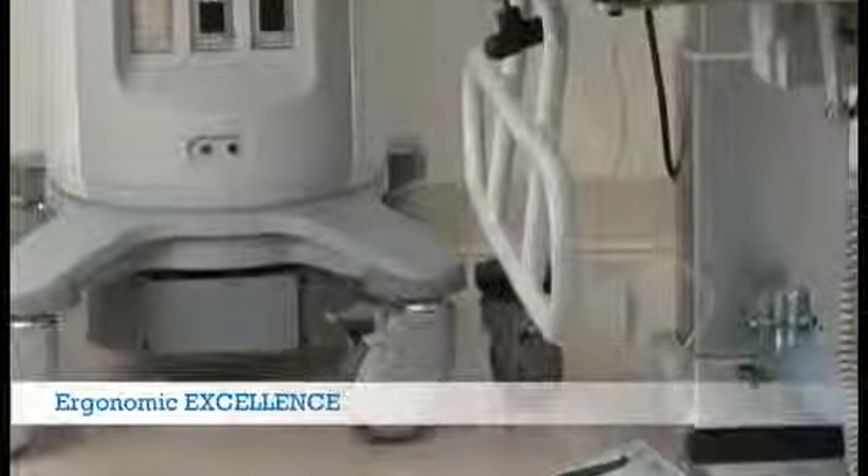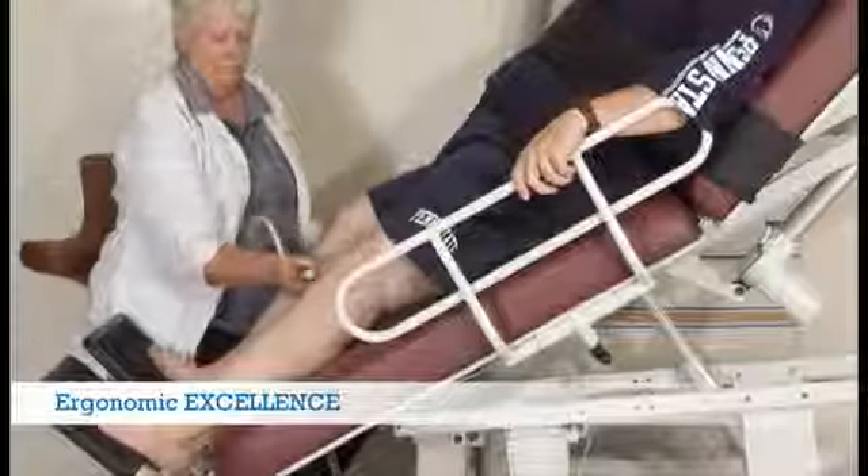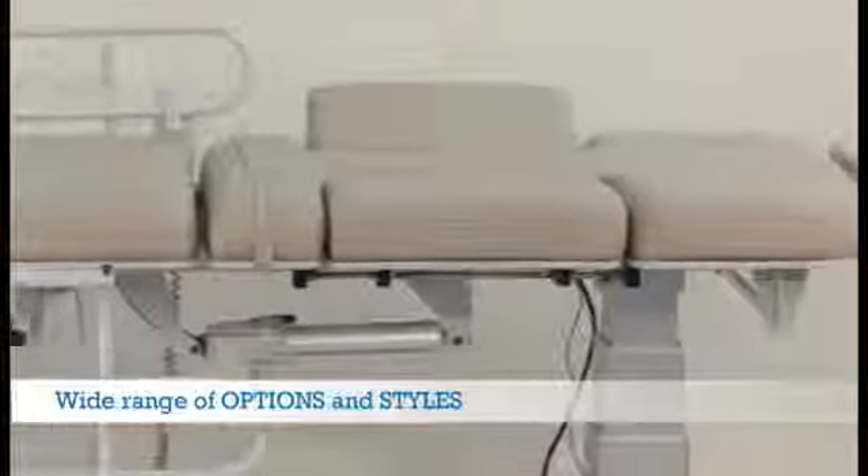Great accessibility with minimal reaching are found in every easy-to-use feature. The narrow base ensures your equipment and you can get as close to the patient as possible. Unique features like those found on our vascular table ensure the best ergonomics.